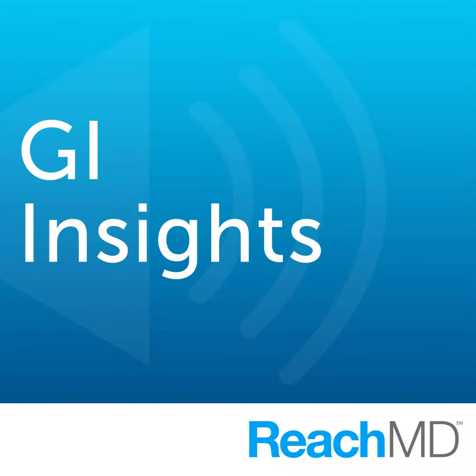Gursimran, now when you're looking at the imaging, what are the characteristics that you want to know about? What are the things that go through your mind in evaluating the candidacy of a stricture for balloon dilation? Yes, so when we review the imaging, and I encourage this more for the fellows and residents listening to our talk, try and review your imaging first yourself, and then obviously sit down with the radiologist. So, location of the stricture.